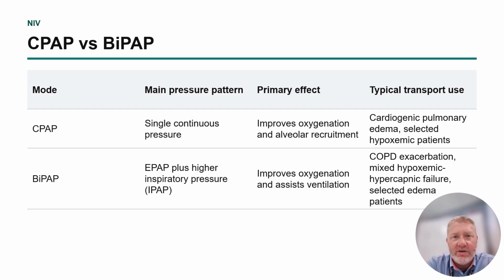Depending on the device that you are running non-invasive ventilation through, you'll have different settings to manipulate. Next week when we get into vents, I'll show you the Hamilton interface, because a lot of rigs have the Hamilton T1 or C1, and I'll show you how CPAP and BiPAP look on that.